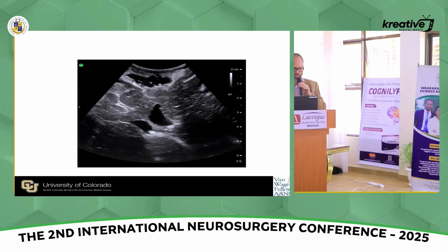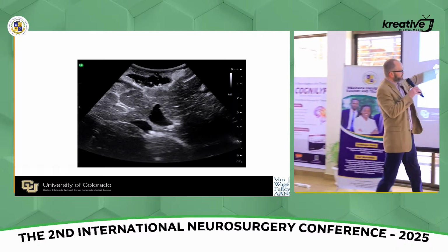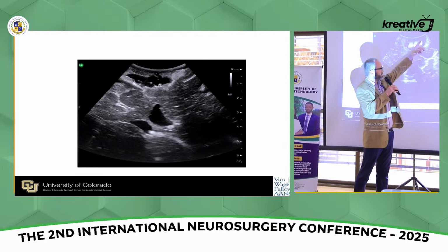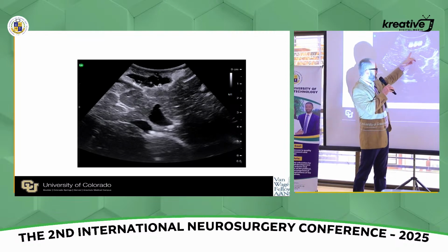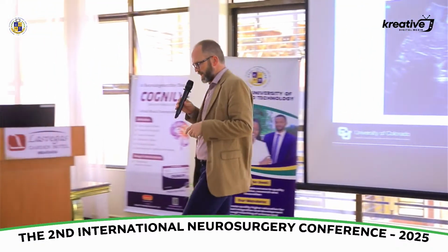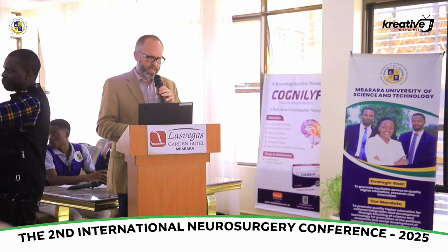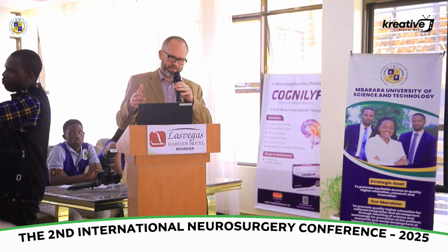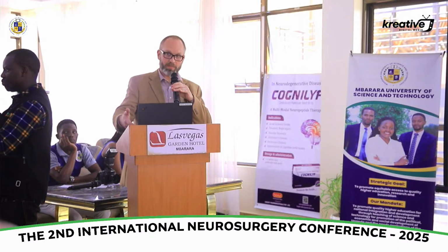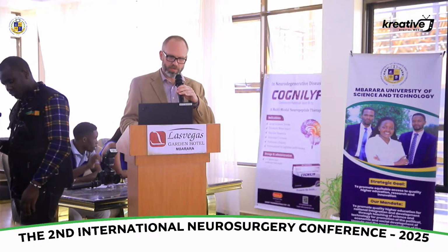This is a cottonoid, so you can see there is some attenuation. So you see you have that artifact of it being bright on either side here past the fluid, but this blocks signal, so it's darker here. Okay, so just be aware there is a signal attenuation from anything that you put in the cavity. And if you have fluid in the cavity, that allows you to use the ultrasound, so that's important, but it's going to be brighter at the back wall of that fluid cavity, so don't confuse that for tumor.